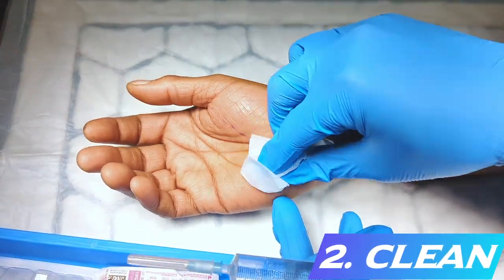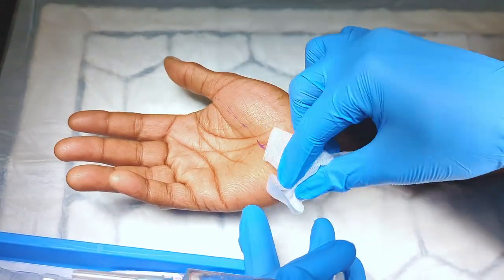The area is cleaned thoroughly to avoid transferring skin flora to deeper tissues.